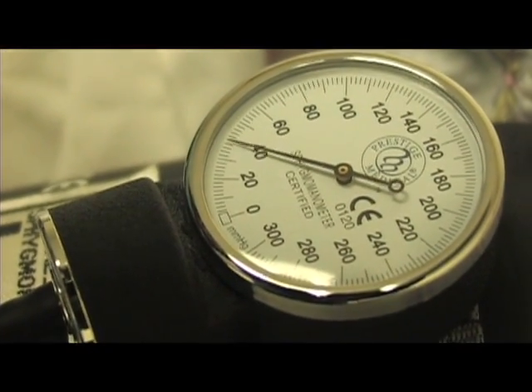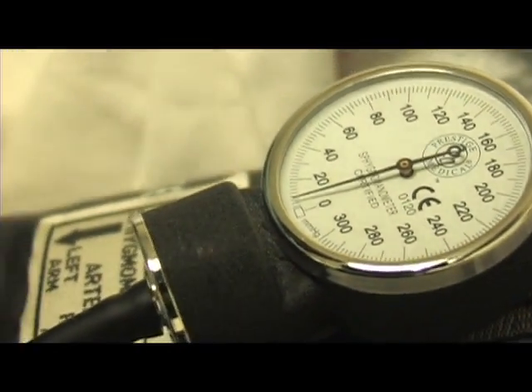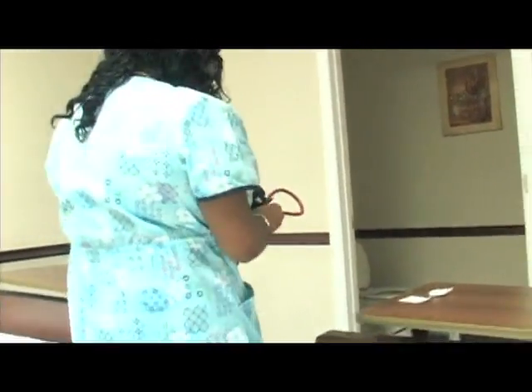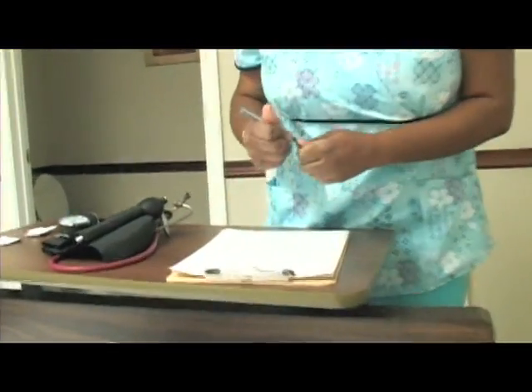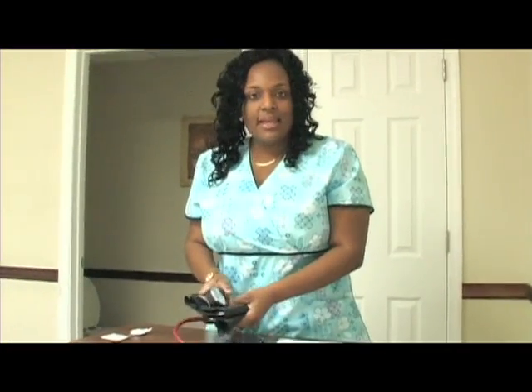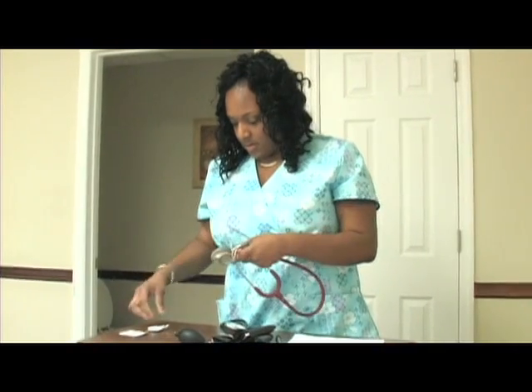The last thump you hear is the diastolic blood pressure. Remove your blood pressure cuff, document your numbers, and clean your equipment at the end of your skill.